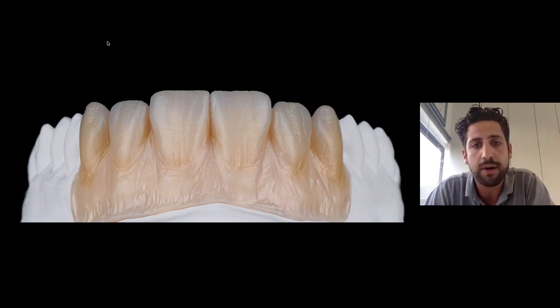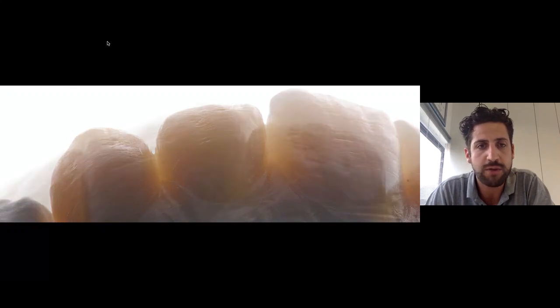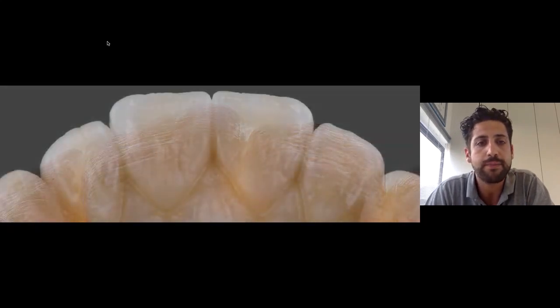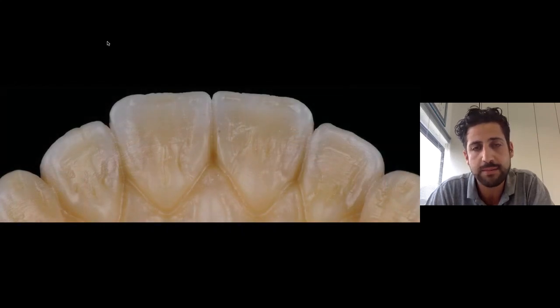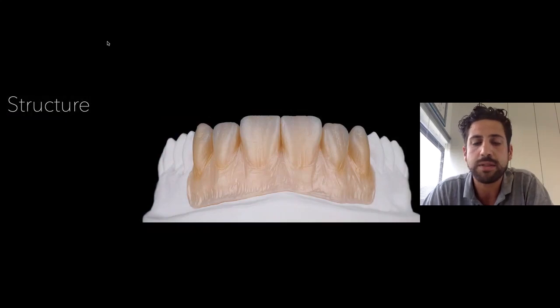This is our structure ready for the build-up. We can check our structure, our surface before the layering. This is the palatal side. This is the palatal with the light. We can see how the light can go inside of the zirconia. But let's speak about the protocol.